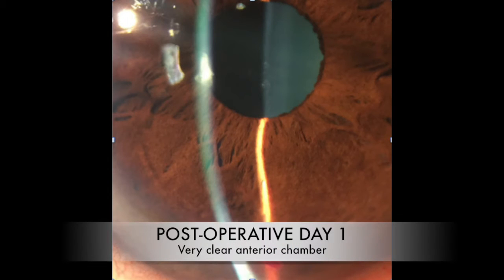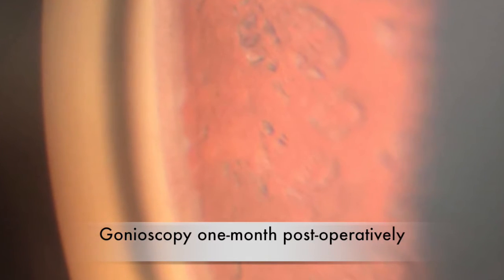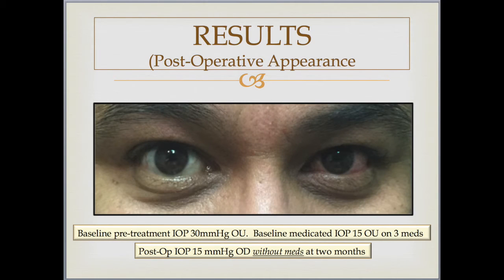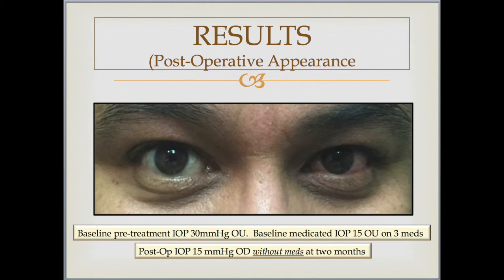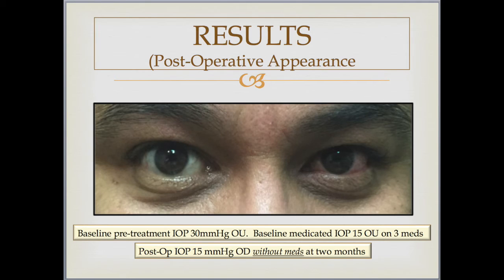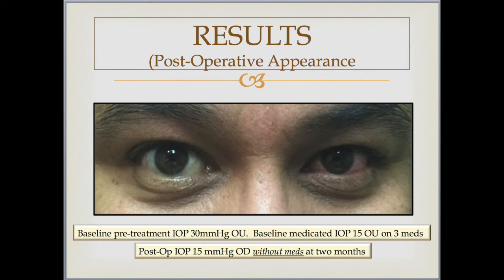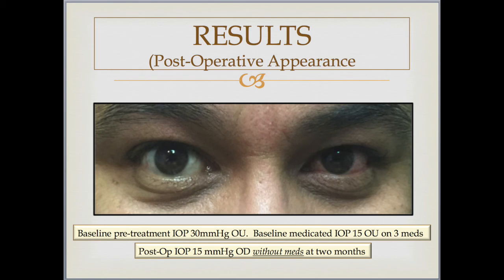On postoperative day 1, there's minimal anterior chamber reaction and minimal heme within the anterior chamber; the heme is limited to the paracentesis site. Gonioscopy at the 1-month mark shows very little evidence of any trauma to the trabecular meshwork. The patient in this surgical video was a young man with controlled glaucoma on three medications but highly intolerant to his meds. He had baseline untreated IOPs of 30 OU and medicated IOPs of 15 OU. Two months postoperatively, his IOP is 15 and medication free, while his left eye is still on medications and he is anxiously awaiting his procedure in the left eye.